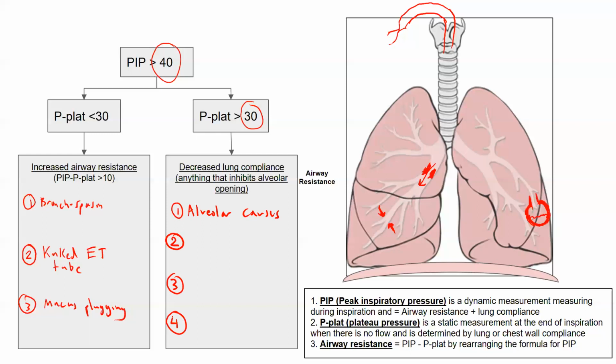Obesity, yeah, exactly. So that's number four: obesity can do this. If someone is obese, they have compression of their lungs, and that is really going to make it more difficult for them to open their lungs, which is going to increase the alveolar pressure and the plateau pressure. So obesity is a big one, and something you'll see in the ICU. You'll see this in real time with someone who is obese having higher plateau pressures.